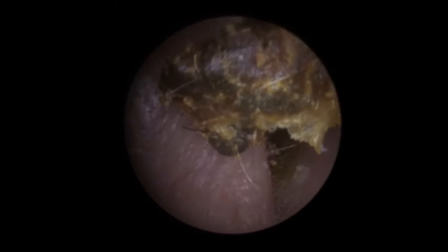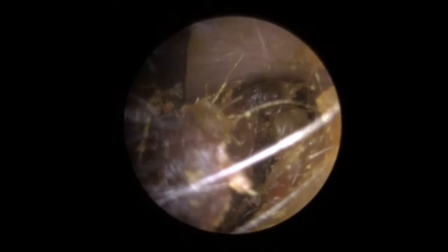There we are — it's actually taking some of that front section with it as well. You can see it's very, very dark, almost a very deep chestnut-y brown colour. And then we're going to go and get this next section away here. A lot of it is stuck and tucked around this left-hand bend. I'm going to pull along that left-hand canal wall, which is going to draw more of this out. You can see that's taking another big chunk — a very deep, smooth section — and that's bringing everything slowly forwards.